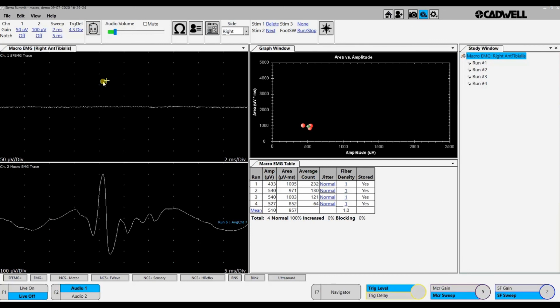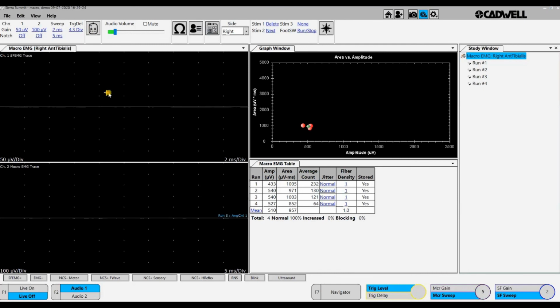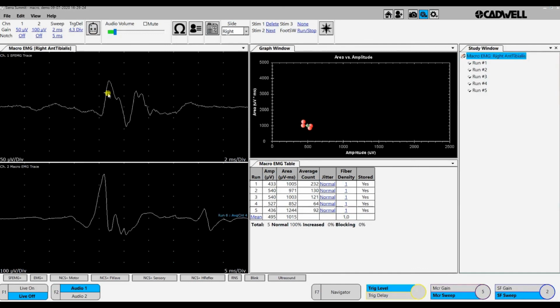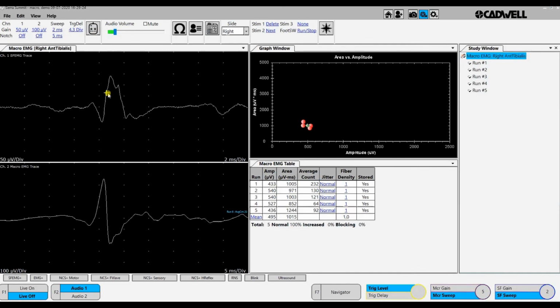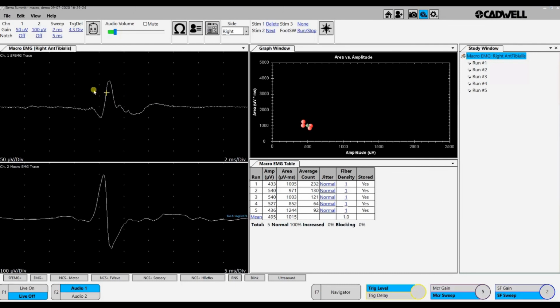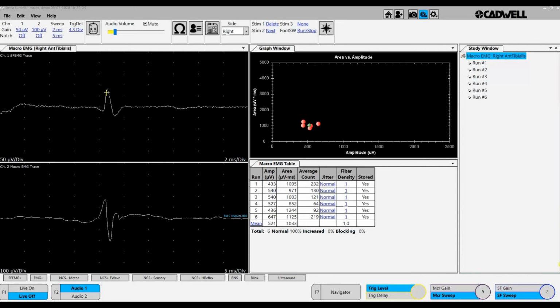It's another motor unit potential, more irregular, a small one here, and that has another shape, has another amplitude. It's a slight tremor in this recording. I stop. I reset and started the averaging, and you see this one looks irregular because it's sometimes summated with other motor unit potentials.